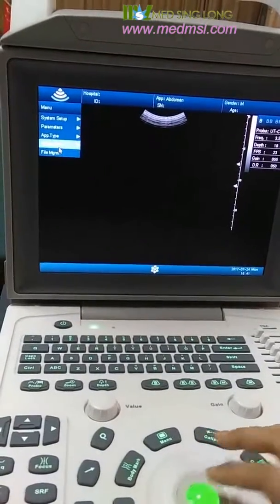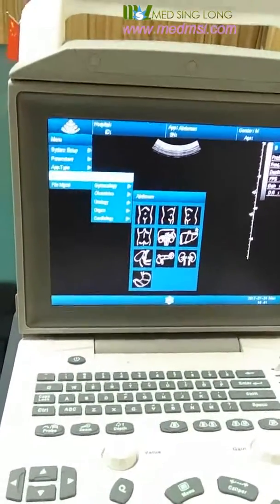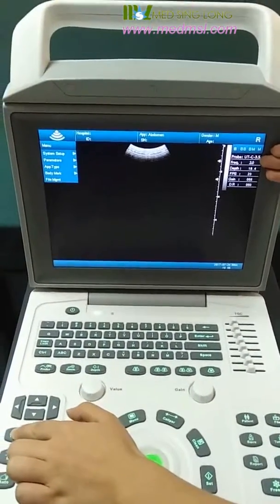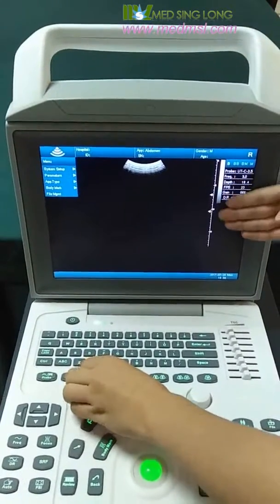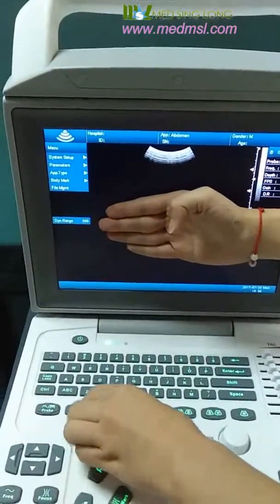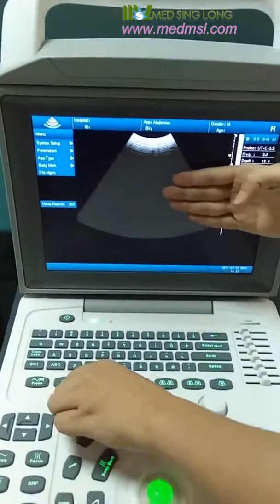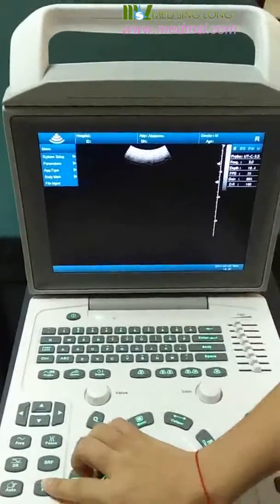You can see different body marks here. This is the area for parameter adjustment. The first is frequency — it can be changed. The second is focus — the focus area can be changed. The third is dynamic range — you can adjust it here. Next is the speckle noise reduction function, and noise restraint. And next is the full-screen image — one key for full-screen.